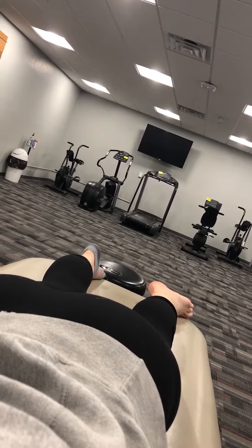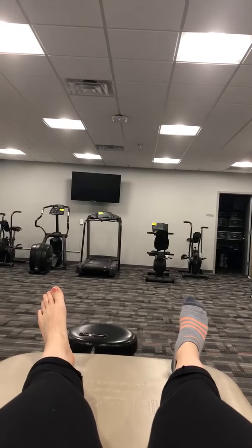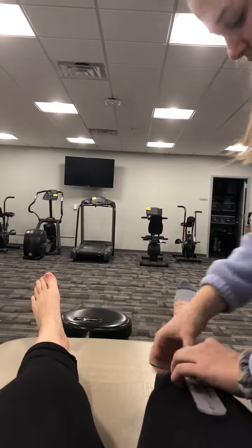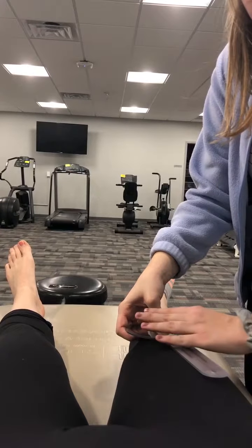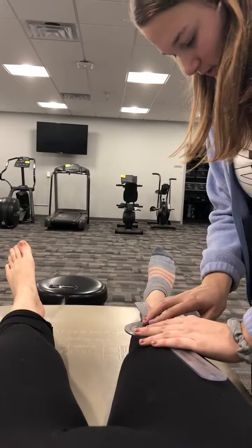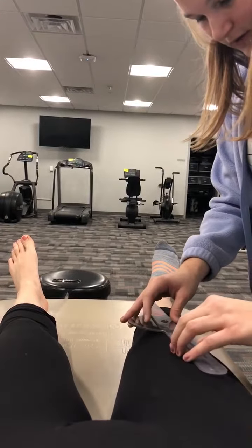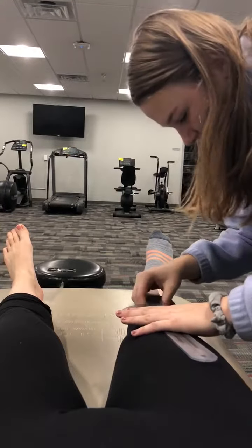Now we're going to test her Q angle, so I'm going to have you flip over again. Grab the goniometer. And for that one, I'm going to put the fulcrum over her patella. The stationary arm goes up towards her ASIS, and the movement arm goes towards her tibial tuberosity.